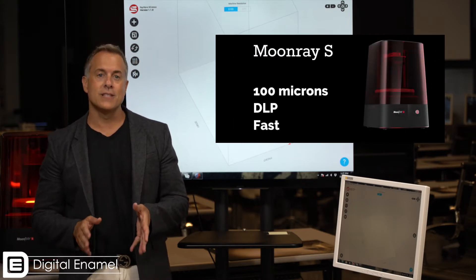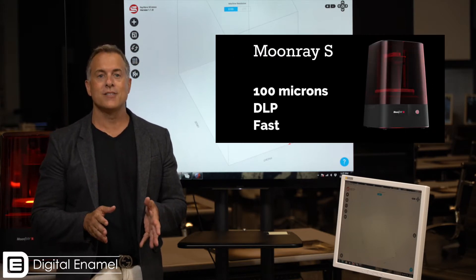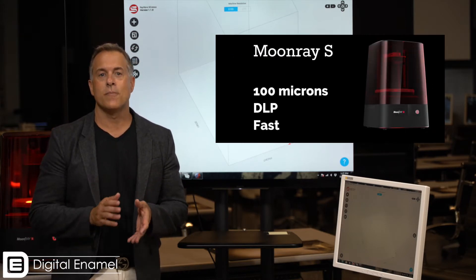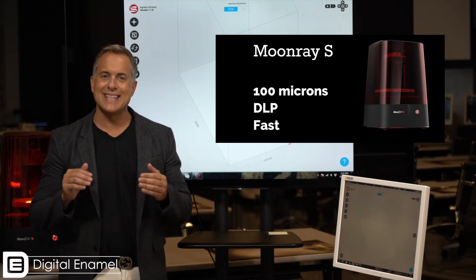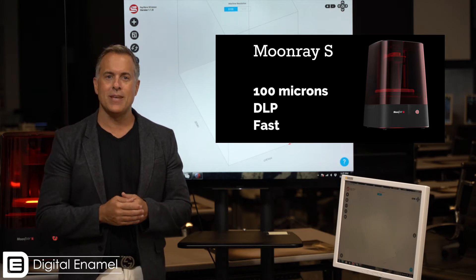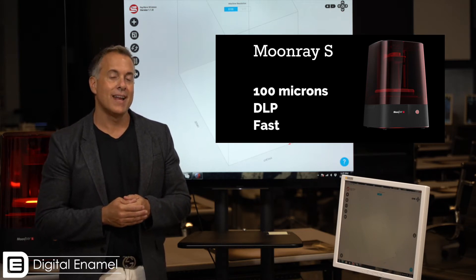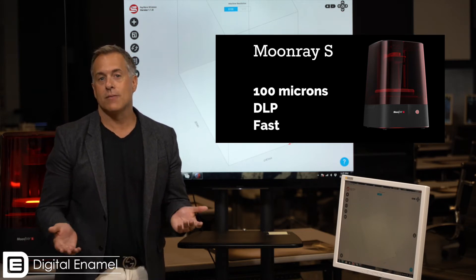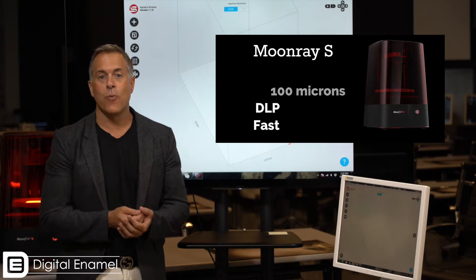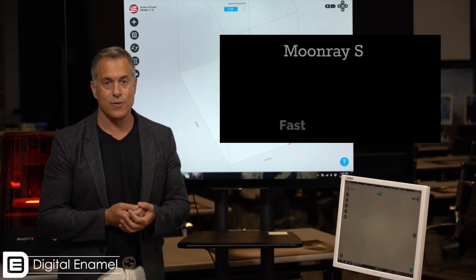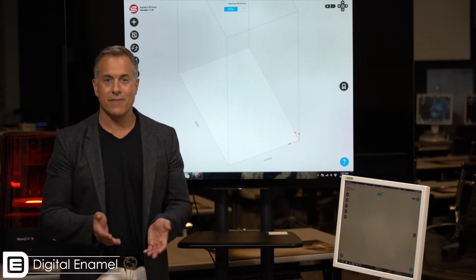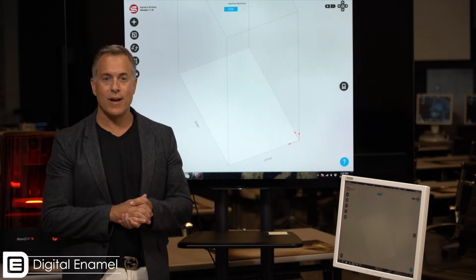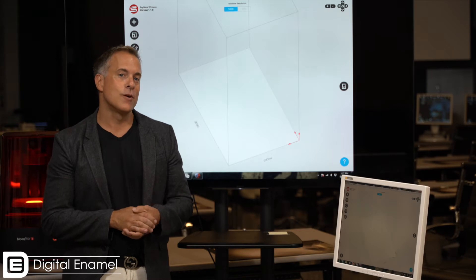A couple cool things about the MoonRay S: MoonRay S prints at 100 micron resolutions, is a DLP printer, and it can print dental models in well under two hours, surgical guides definitely under one hour. So we're gonna go ahead and go through the steps to get this set up.